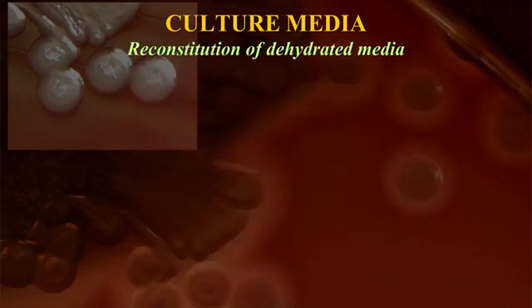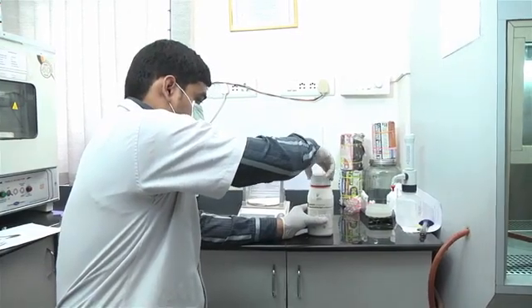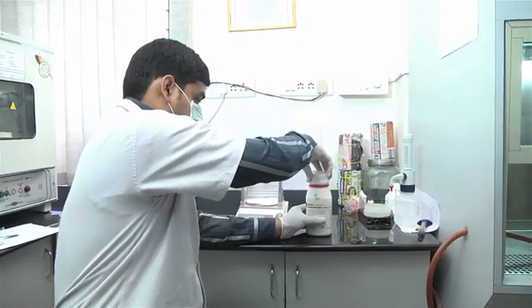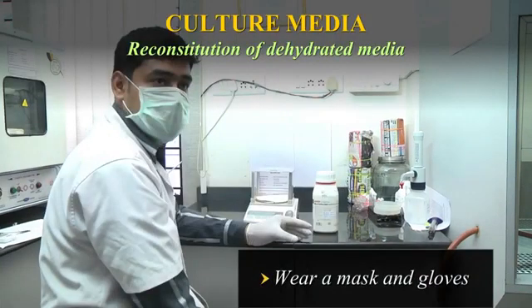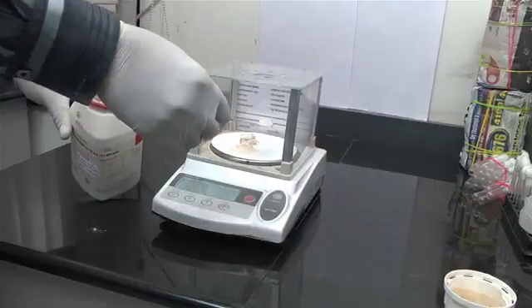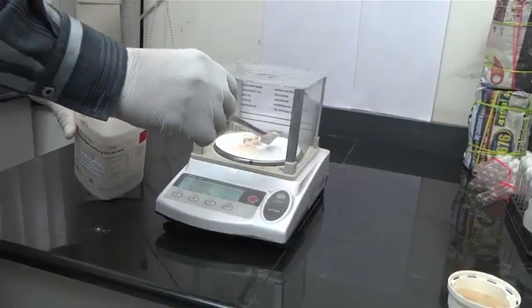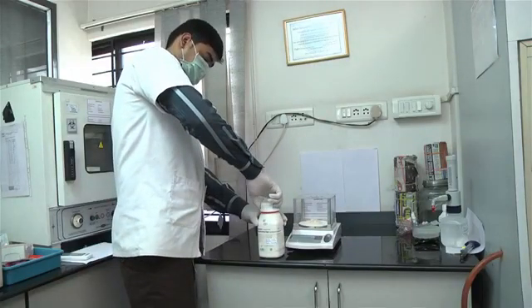Reconstitution of dehydrated media. Always use freshly prepared distilled or deionized water. Open the culture medium container away from current of air or moisture. Wear a mask and gloves. Weigh the powder quickly, accurately, and without creating clouds of dust. Close the container as soon as possible.